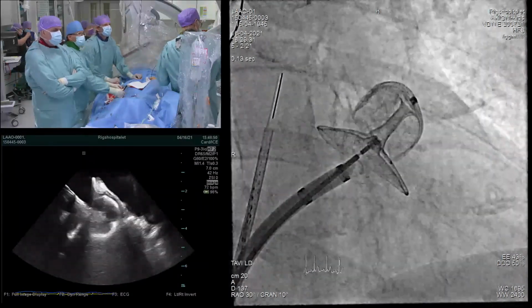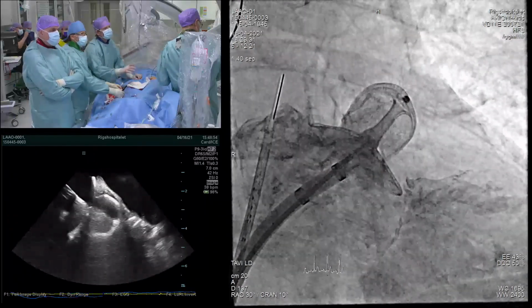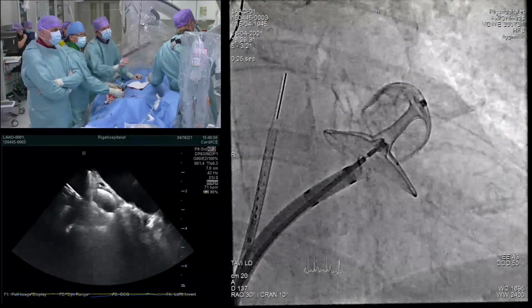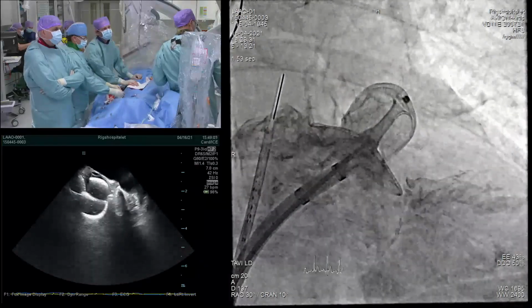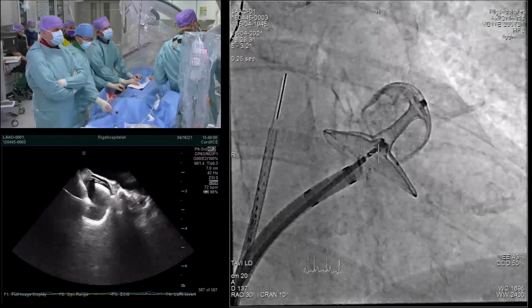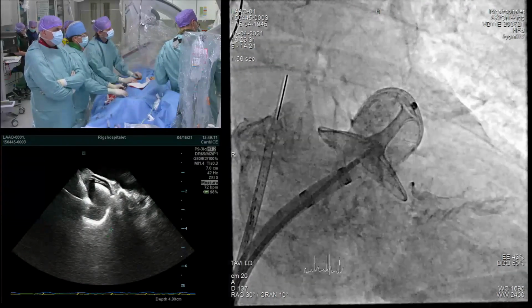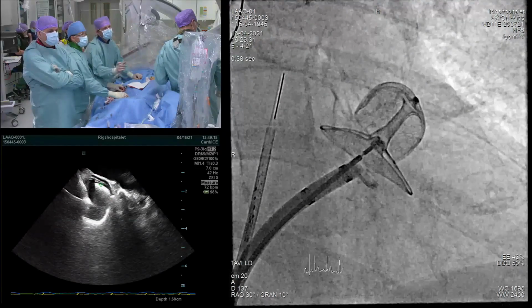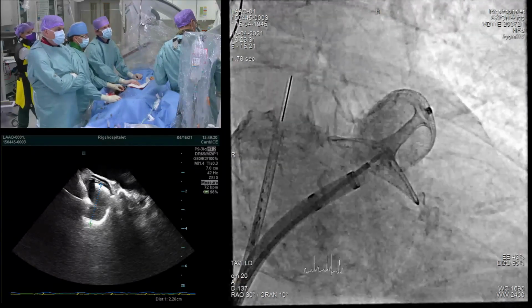So what we like to see on this device is, first of all, compression on the cup. And that's something we absolutely see. Then typically if the cup gets compressed, you get this more rectangular configuration, as you see here. So that's a good thing. Then to see if it's deep enough, you can see this also on the fluoro in a way, but it's even better to assess this on the ICE. Maybe Niels can show that later, that the cup is at least 2/3 distal of the circumflex artery.